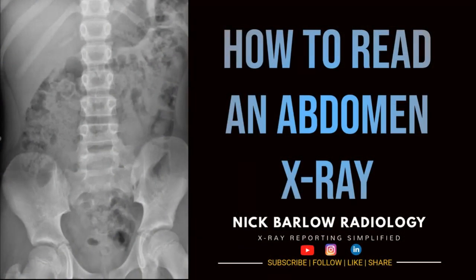So I thought I'd do this very short video. It's not going to be as long as the chest because there's not as much to talk about with abdomens, but maybe later we'll do videos on specific abdomen pathologies as well. So without further ado, let's get to it.